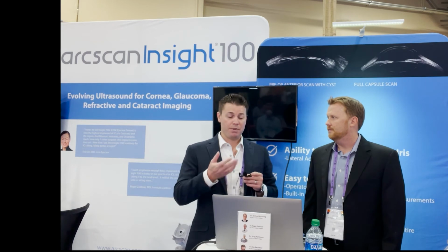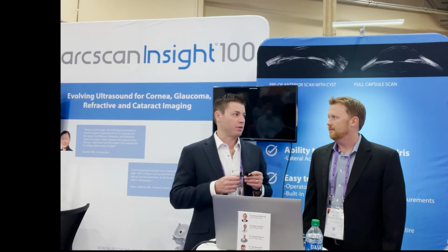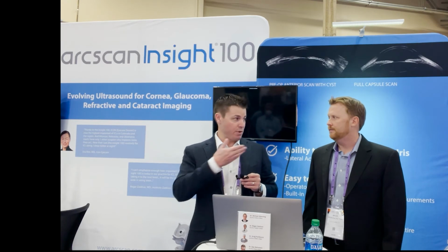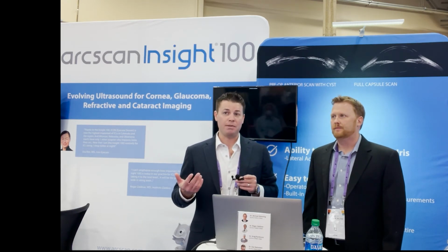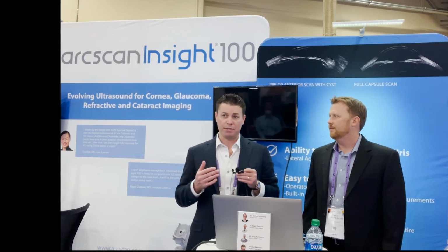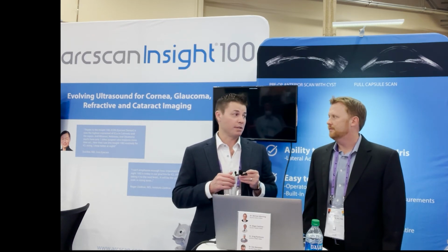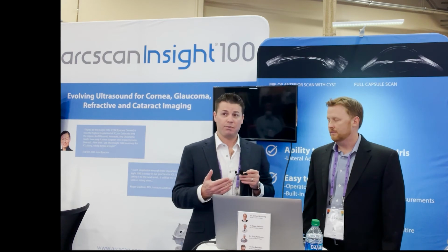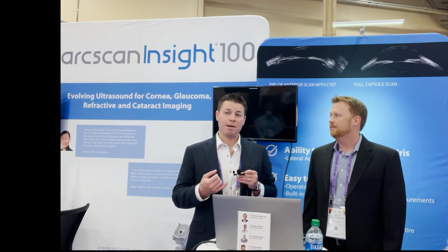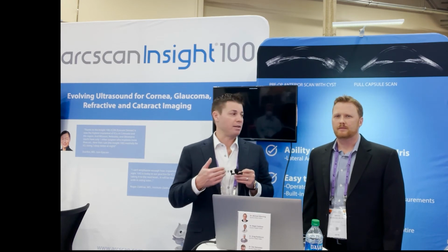You pointed out that with this newer nomogram, I don't think the surgeon has to be the one doing the measurements anymore. But before this, we were. We'd spend 10 or 15 minutes at the computer with the prior UBM deciding what size we were going to use. So there was a lot of time sink. It was worth it. We believe UBM technology is better than white-to-white, but it was a huge time sink in the past. And now we can delegate a lot of that.